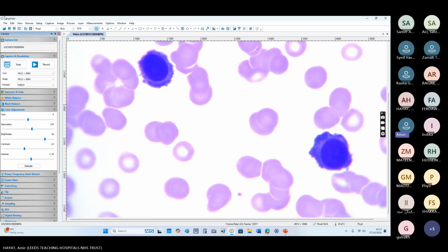But this particular patient has multiple myeloma history already. I would say this blood film contains leukocytosis with red cell rouleau formation and normal platelet count. The plasma cells have typical morphology in the form of an eccentric nucleus and halo formation around the nuclear material.